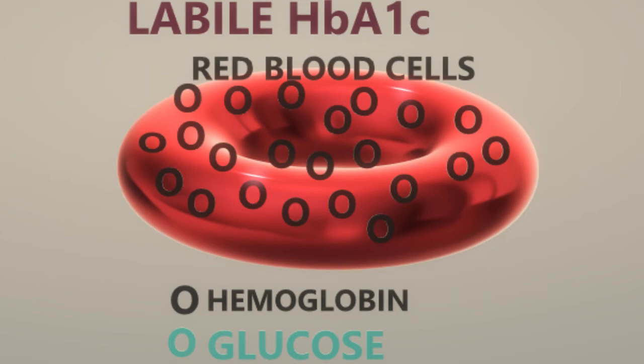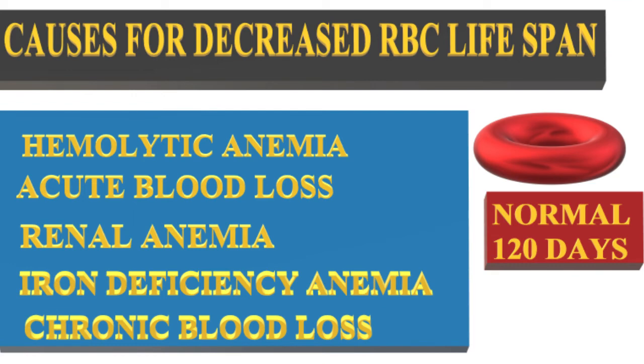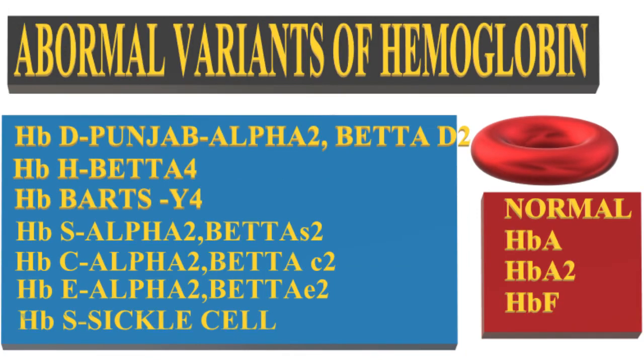The lifespan of red blood cells is a key determinant of hemoglobin concentration. Hemolytic anemia, acute or chronic blood loss can cause inaccurate results. Hemolytic anemia and renal anemias can lower the results, while iron deficiency anemia raises the value and it falls after replacement therapy. Icteric and lipemic samples may falsely elevate results in charge separation methods.